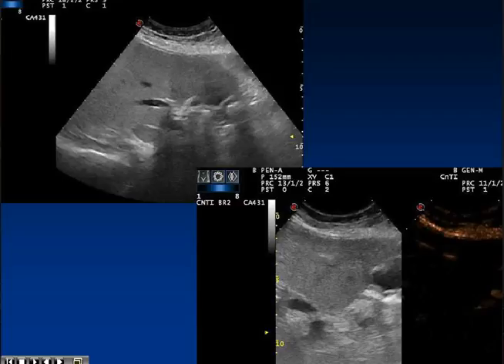And when we go with CEUS, the plasma markers were a little bit raised, so there was this suspicion. Arterial phase, 31 seconds. There is no arterial enhancement. Okay, this is confirmed to be a focal fatty sparing. Good. But then it appears here that it is something different. You see that there is washout. And this is where the metastasis is.